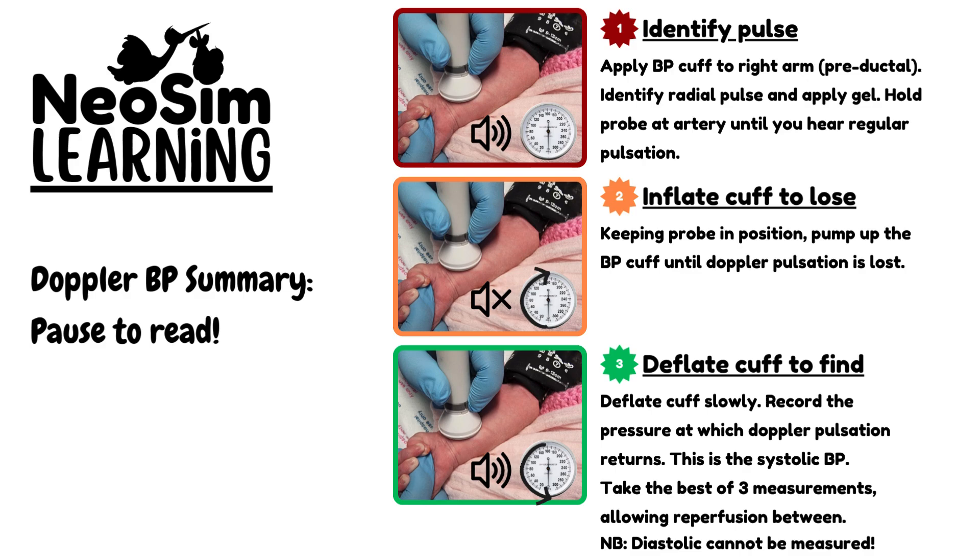When doing a blood pressure like this, we want to do it on the right arm for the most accurate results, and preferably when the baby is well settled, has not recently been handled, and is not agitated. Repeat this process three times and take the best of three measurements. This is only for a systolic measurement — you will not get a diastolic.